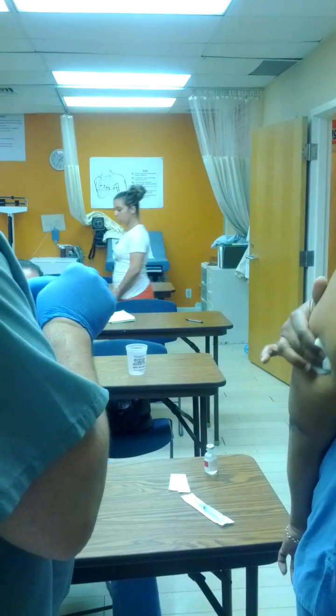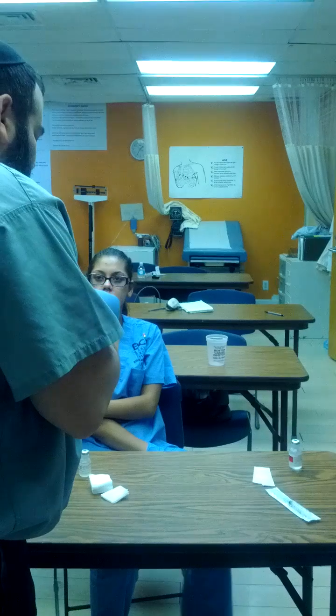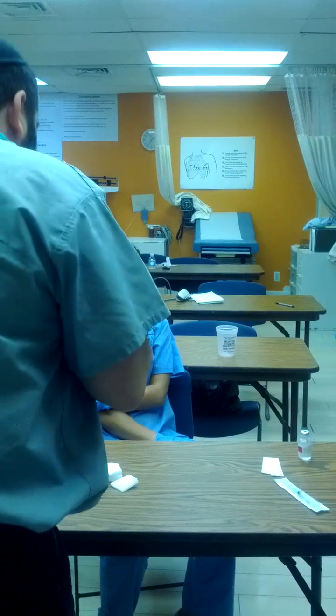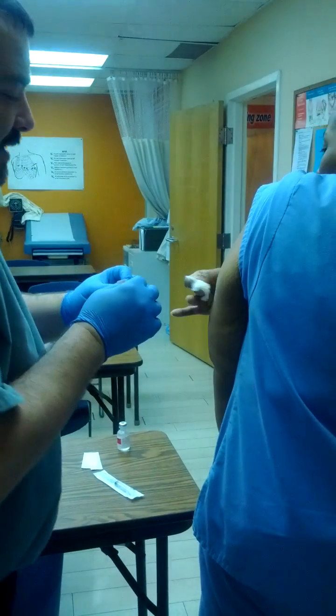You will feel the needle coming out. What happens is, after you've been injecting a person for a while, the tissues begin to gather around your needle, and as you extract the needle from the patient, you're basically just separating the tissues one more time, creating some pain.